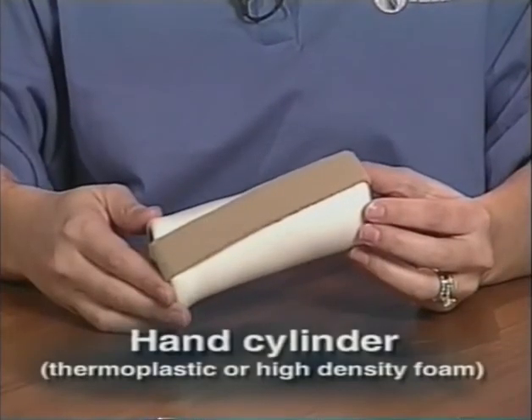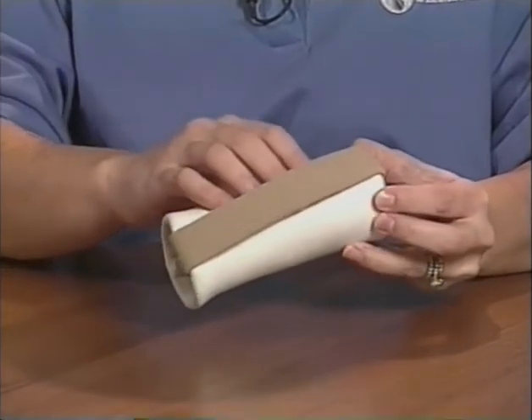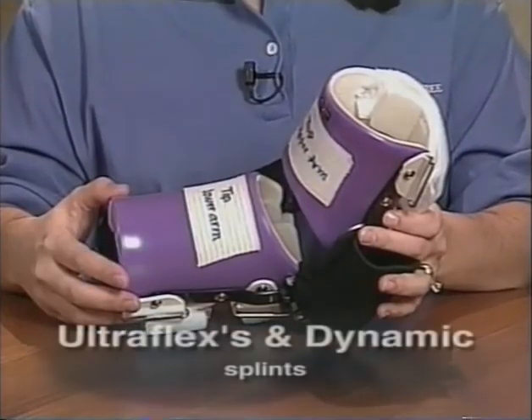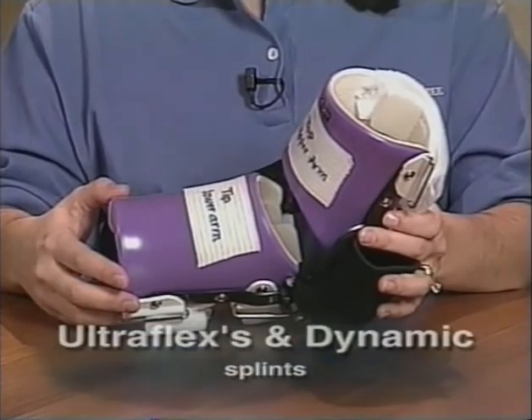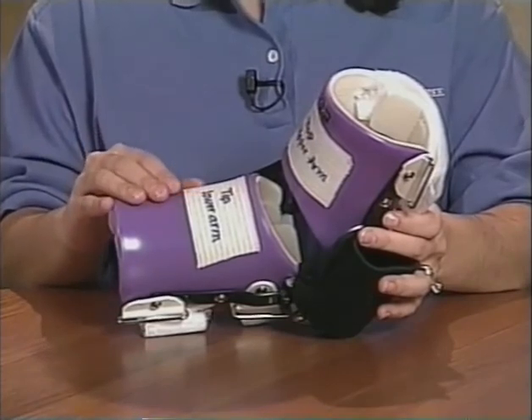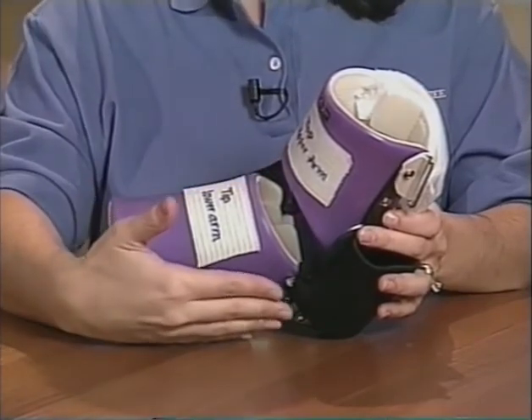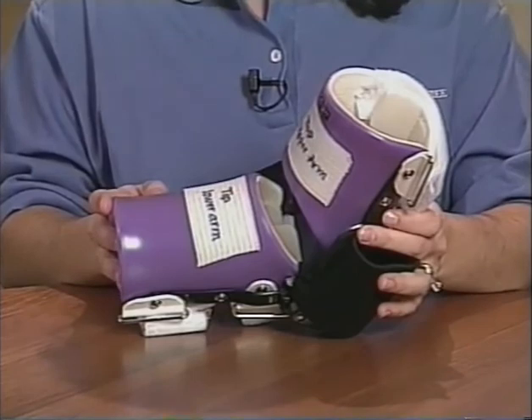This is a hand cylinder made out of thermoplastic or high-density foam. The purpose of this orthotic is to keep the hand in an open position. Ultraflexes and Dynasplints are usually used for the elbow or knee joints. The larger cuff fits around the upper arm, the smaller cuff around the forearm, taking care that the orthotic joint fits securely with the client's joint. There's a lock mechanism to assist with application, which is then disengaged to apply a stretch to the joint.